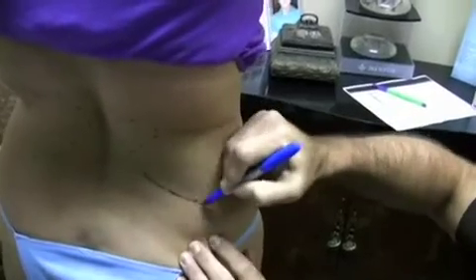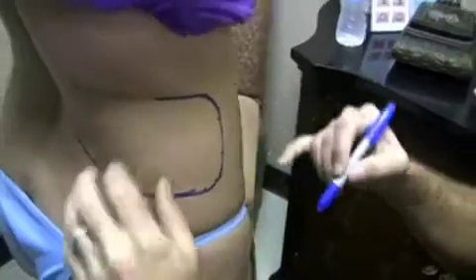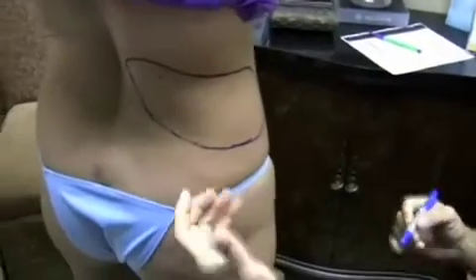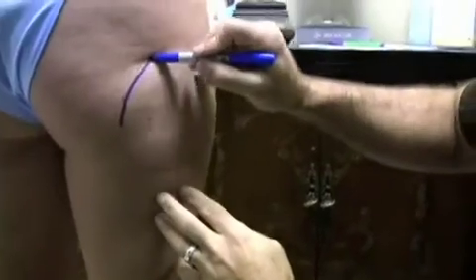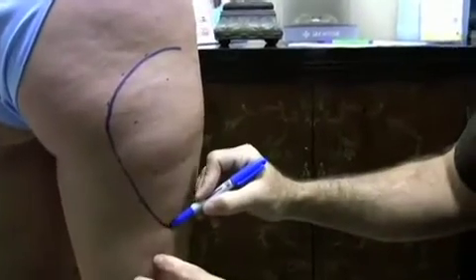This is just a topographic marking of the areas that we're going to be suctioning, to use as a road map during the surgery, because when a patient lies down, some of this is distorted. The nice thing about doing this under local is that the patient is awake, so they can cooperate with us, and we can visualize this in a more normal anatomic orientation. When liposuction is performed under general anesthesia, the patient is flat, and it's very difficult to visualize this if a patient is lying on a table flat.